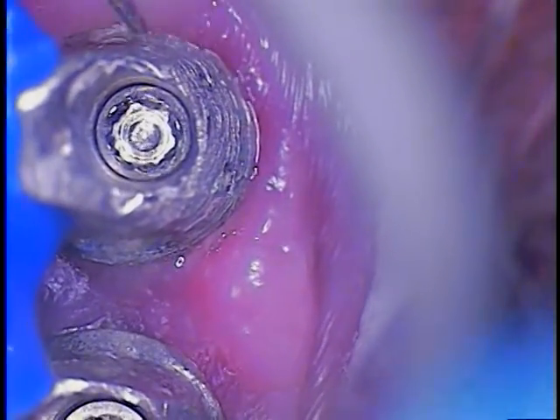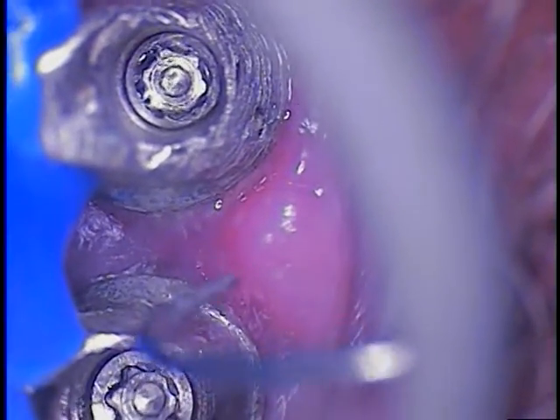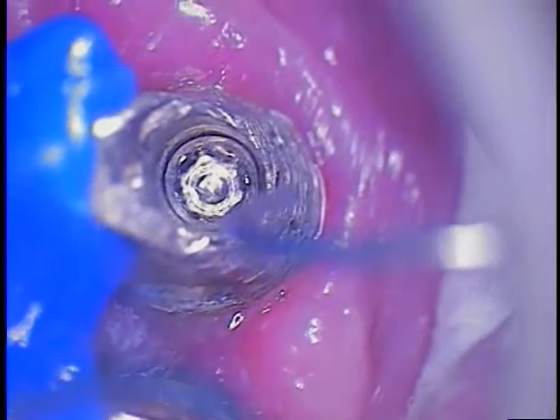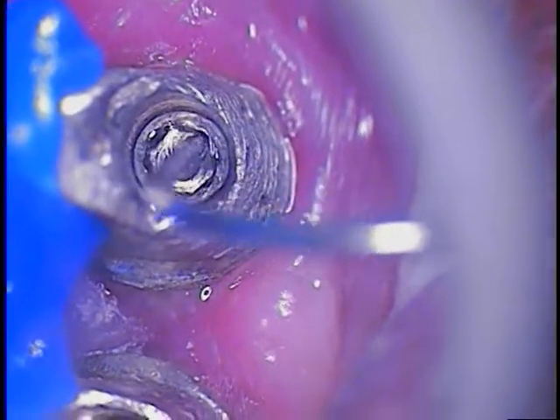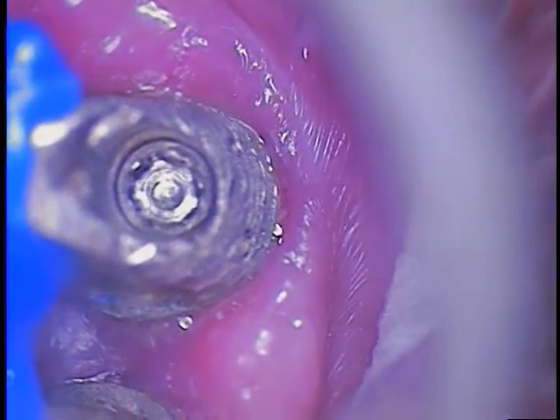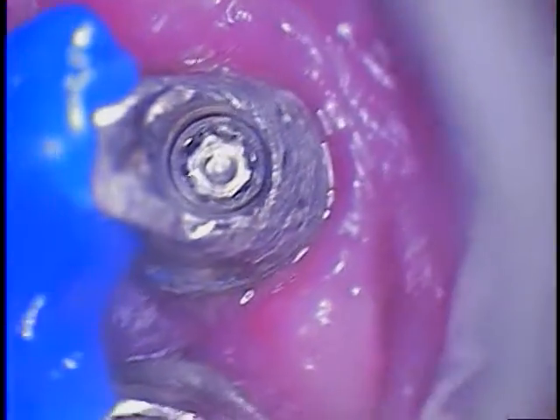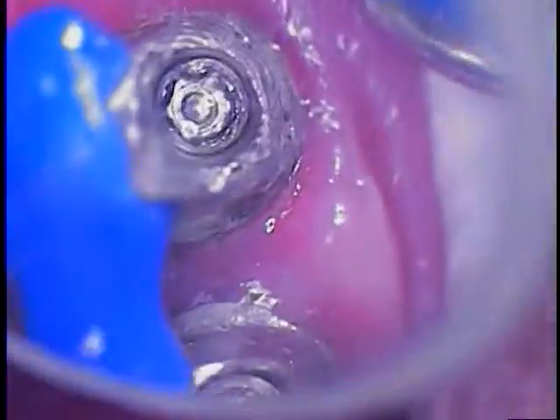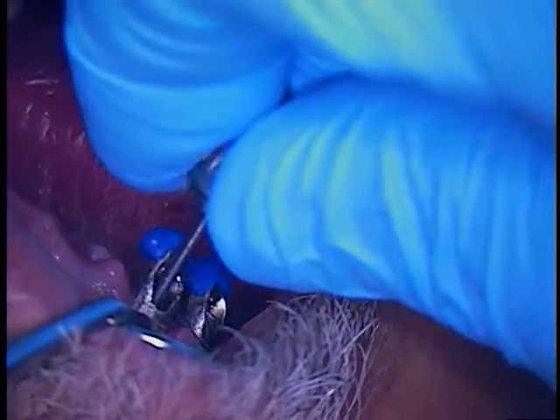So studying the screw head and learning a little bit more about that — the seating of the driver, how much that's important. You can see there's a little bit of exudate coming from the side of this implant. I'm going to bring that to the dentist's attention, especially if they're going to do a hybrid on this tooth. Maybe get that off, clean it thoroughly in hygiene, maybe put some Arrestin or any kind of antibiotic in there to help the cause, or just water picking. Water picking does a lot, especially with implants. So we're going to continue to work on this. We're going to use a driver by hand — we don't need the wrench anymore. We just use the driver to make sure it's seated, and unscrew it.